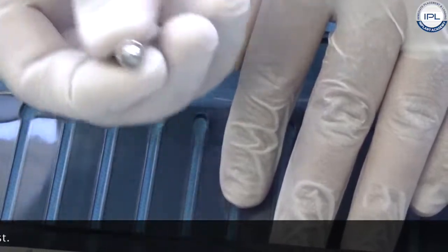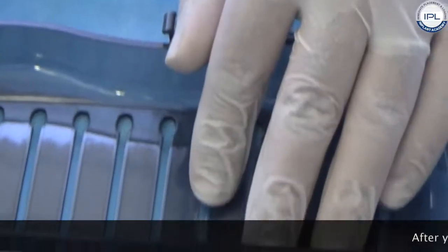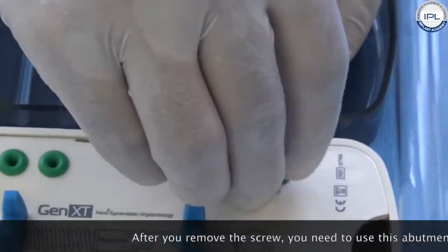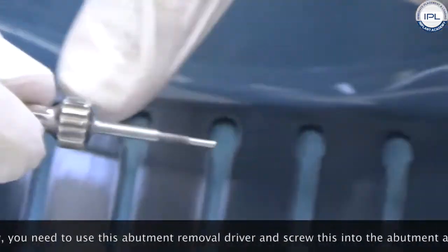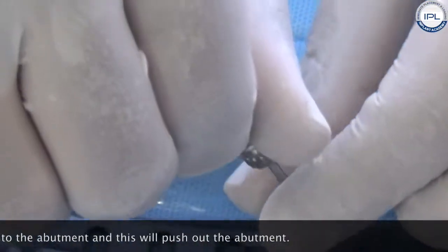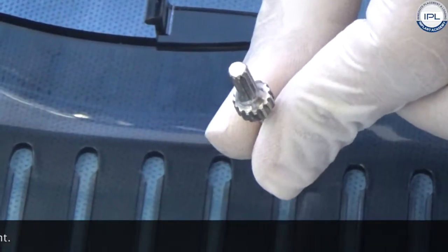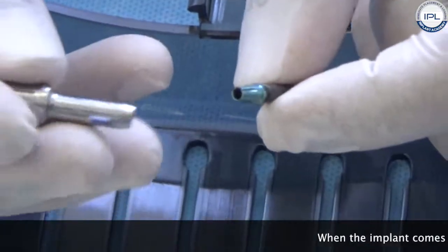The impression post driver is used to engage and disengage the impression post. After you remove the screw, because of the cone connection you need to use the abutment removal driver — you screw this into the abutment, and it pushes the abutment out. Here is the implant; this is how it looks once it comes out of the pack. You can use the single-piece insertion tool to begin inserting the implant.